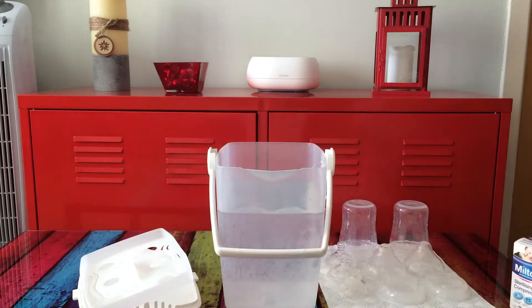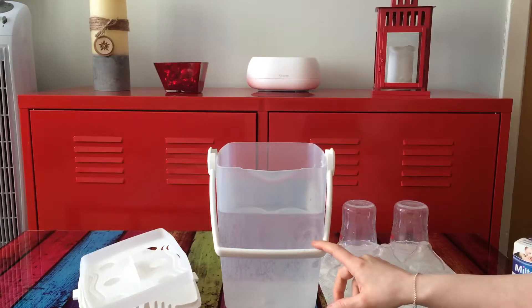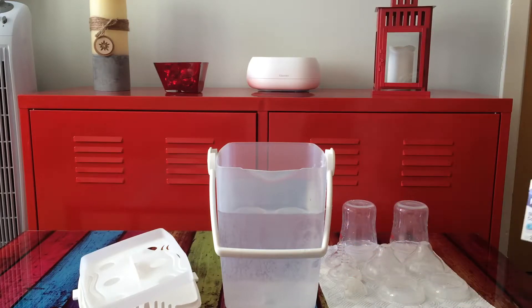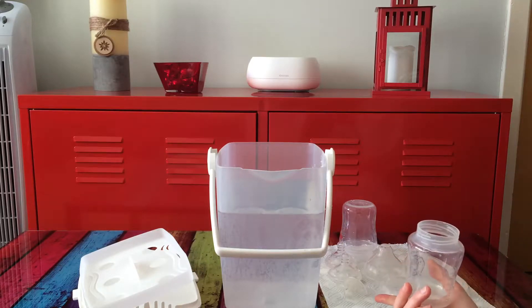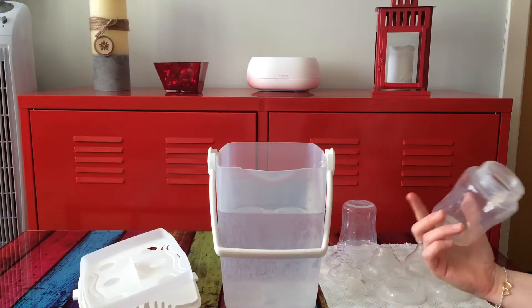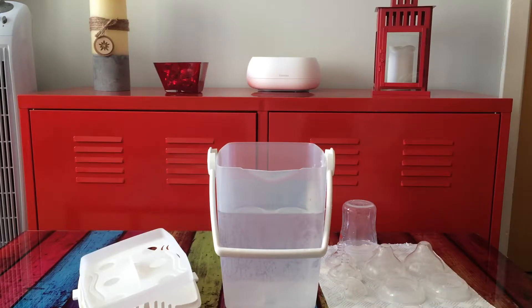All you've got to do is set this up every 24 hours — around the same time would be best. Each item has to stay in it for 15 minutes and can then be used. Before you put the first items in, wait until the tablet has fully dissolved.